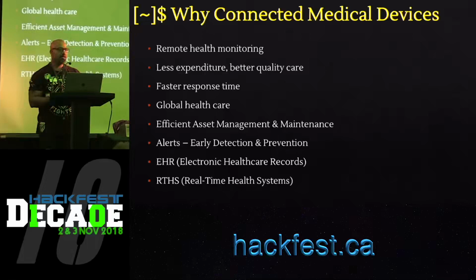We brought it back to our lab. We tried to make them connect to each other, and it just magically worked. There were no questions asked. PDA was like, hey, bro, do you want to talk? Infusion pump was like, yeah, sure, why not? We talk the same language, so let's just talk. So that worked out pretty well for us.